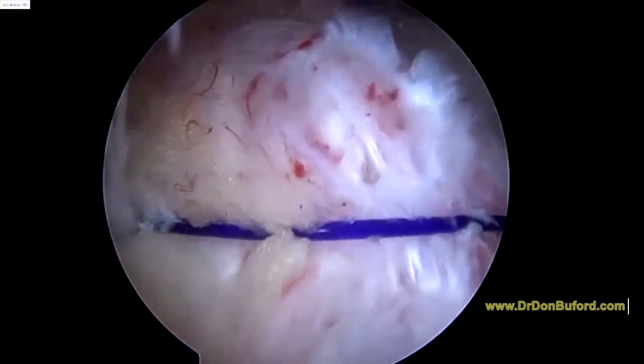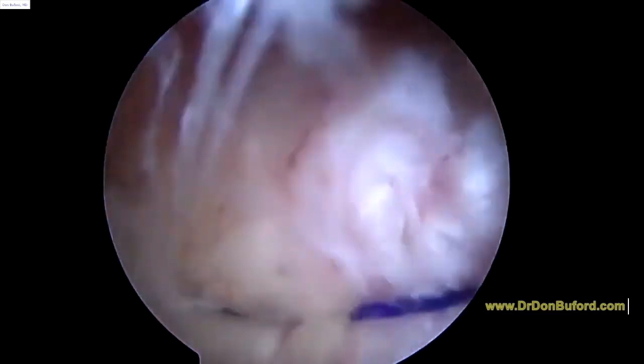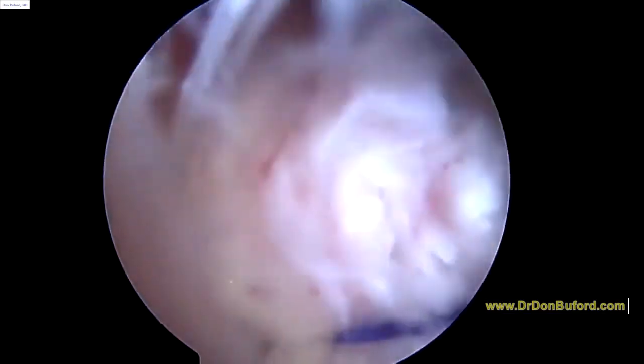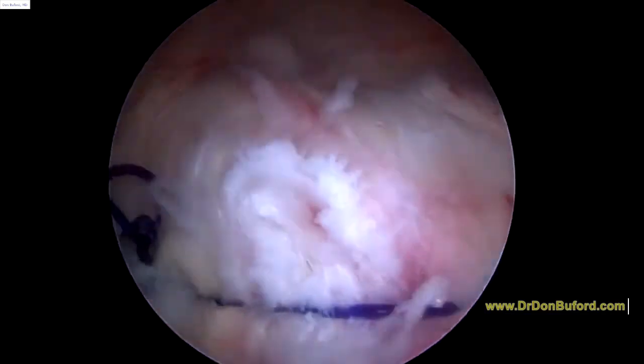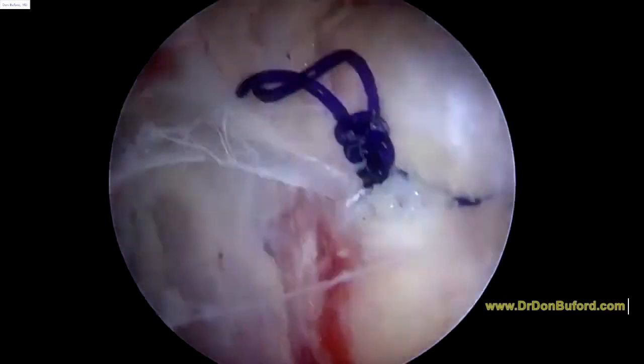See that? That's all it's trying to do — and to prevent that tear from propagating, obviously. You can see how that's sealing that tear over. Tied that stitch. That looks good, as I rotate the arm.